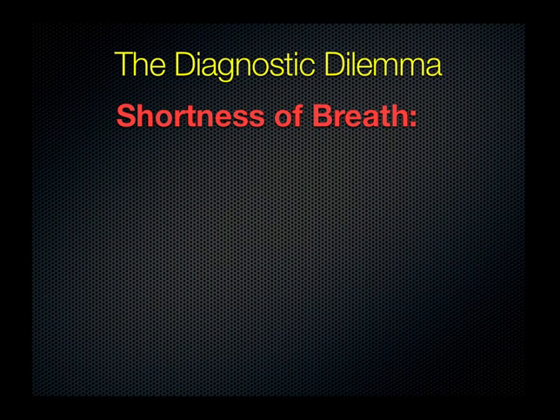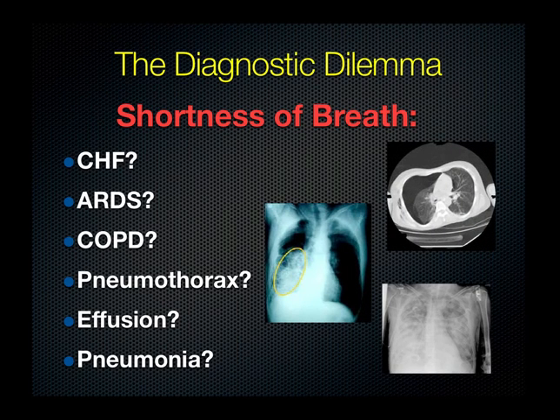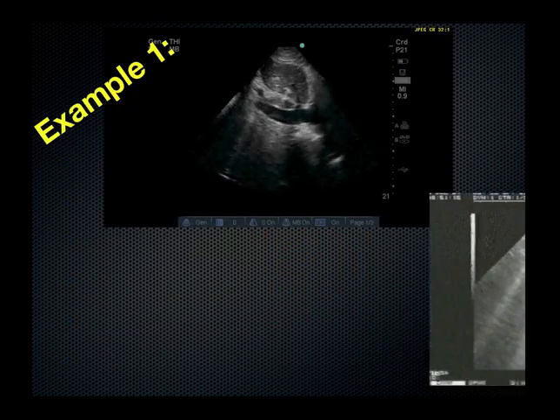So here we go with the diagnostic dilemma. Shortness of breath. Do we have CHF, ARDS, COPD, any number of things? What's going on with this patient? In order to get a jump start on the appropriate therapy, use your ultrasound.